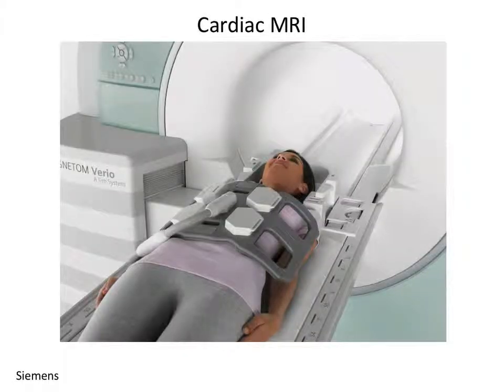And just as some review, recall, we have a magnet, gradient coils inside the magnet, an RF transmitter inside here, inside this tube. This is usually about 80 centimeters to a meter across. And then we have receiver coils picking up signal from the patient. In particular, these receiver coils are isolated around the heart for our applications.